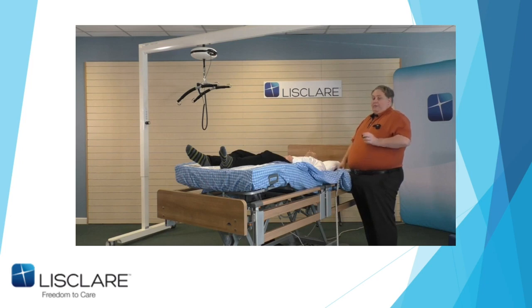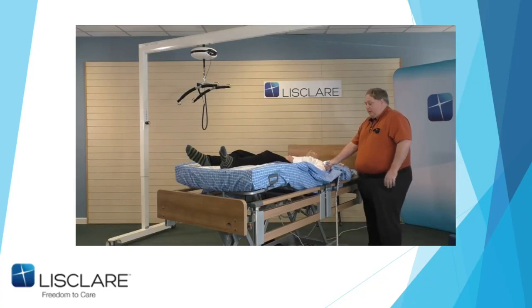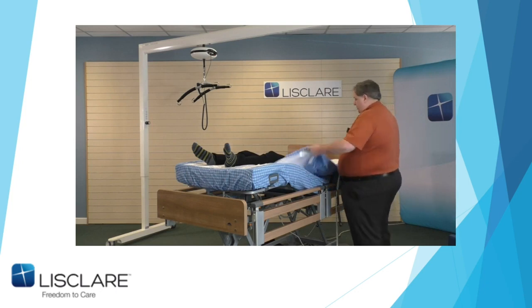And he taught me something at the Scottish Manual Handling Forum. He was asked during the question time by the trainers, well, what happens if the carer has arthritis in their hands? How do they grasp the sheet? And Irv was obviously prepared for it without telling me. Out came a squash ball out of his pocket, goes into the sheet. You can grab here, and it means you don't have to grasp as hard. Again, I get into that position and lean back, and up becomes the bed, okay? Especially bought for this afternoon. Thank goodness the sports shop beside is open.